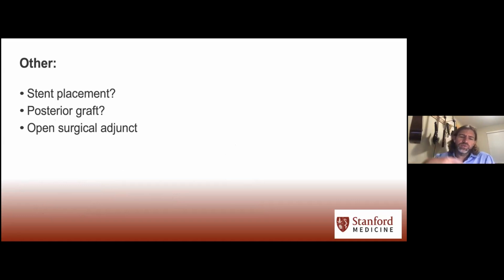There are also times where you're taking the silicone Hood stents, and those Hood stents at baseline are open. You kind of have to fold them up and jam them in the location you want them to go, but they're not always sitting completely open. And so you can put a balloon in there and just pop it open to the size it's supposed to be.